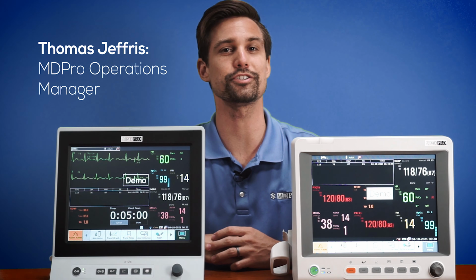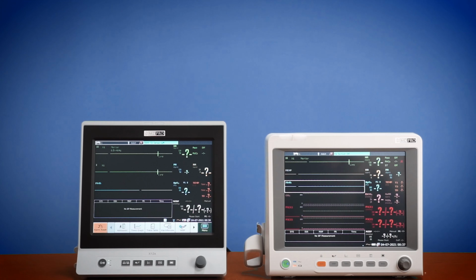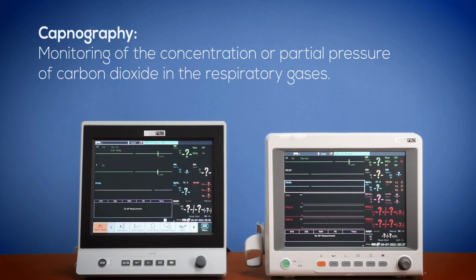I'm the operations manager here at MDPro, and today we're going to be going over capnography. CO2 measurement goes by many names, end-tidal CO2, capnography being the primary two. Either way, it's the monitoring of concentration or partial pressure of carbon dioxide in the respiratory gases.